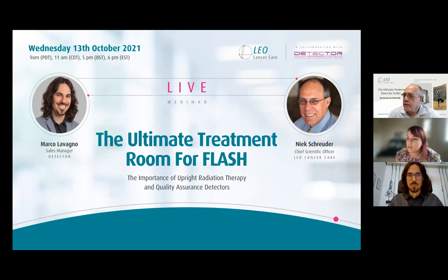Okay. Do you perform 2D dose reconstruction from the strips, or do you just use the strips for the position and profile information and use the integral chamber for the dose information? We use the strips basically for position and profile information, and use the integral chamber for the dose information, so let's say for the particle flux information. For the 2D dose reconstruction, I would say it's probably better to have a pixel device, because you have a direct shape of the beam and not just the projection of the beam in X and Y.